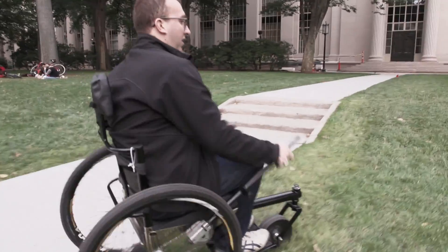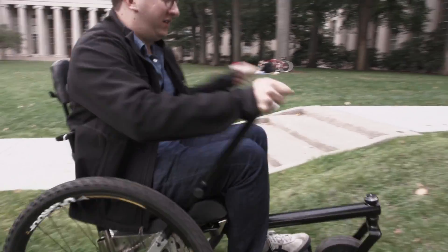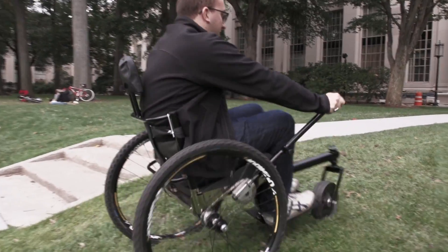On rough terrain, where you need more leverage to get over obstacles, you can slide your hands to the top of the lever. This gives you the leverage you need to really power over dirt, grass, snow, sand — anything that you'd encounter on the trail.